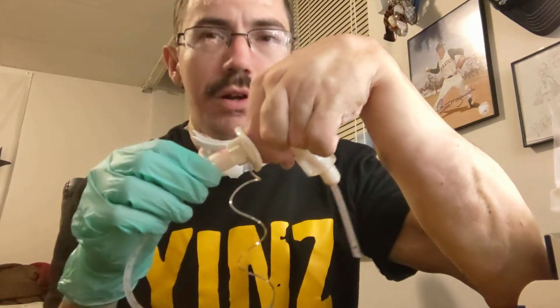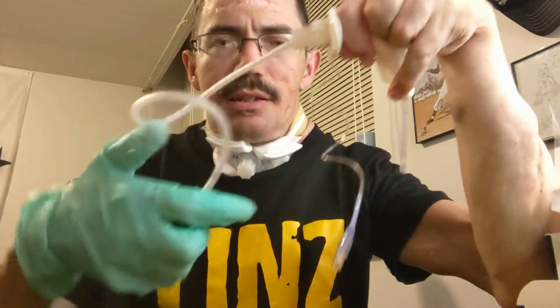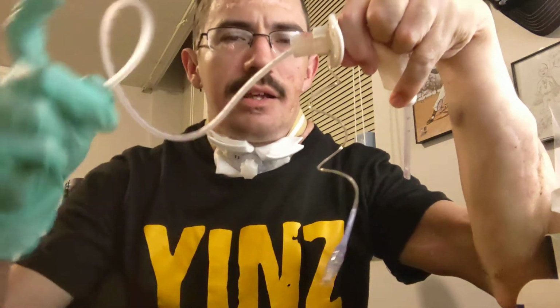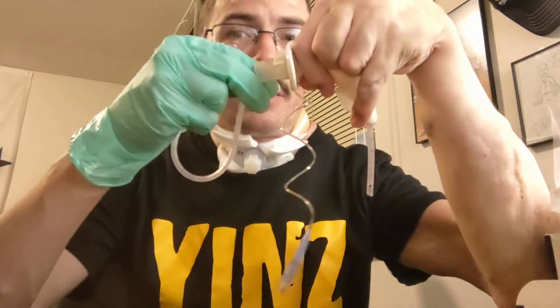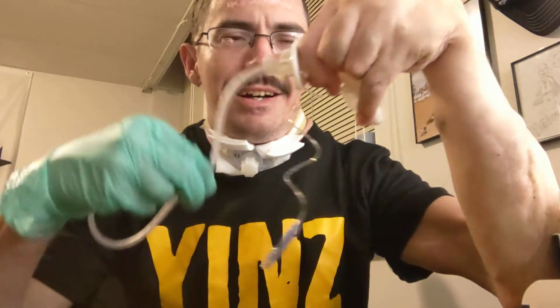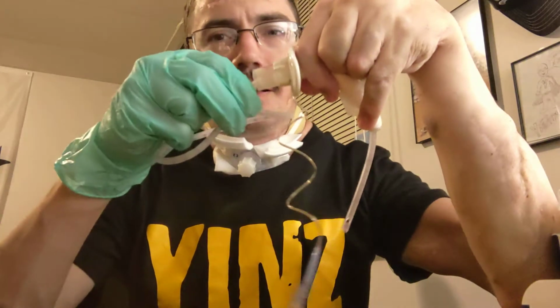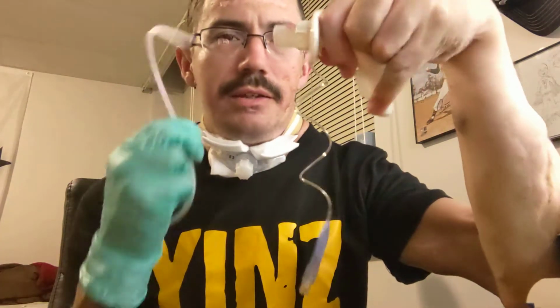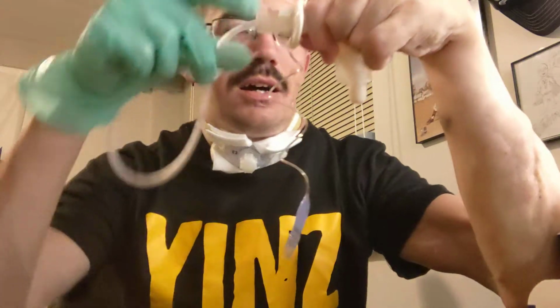and usually your lungs will let you know, hey, this is going a bit far, because you'll feel a bit of coughing. You're going to cough anyway, just because you're suctioning, and it's not a pleasant feeling, to say the least. But then you push down on that, and you pull the catheter out as it sucks it out, and you try to do it slowly, because it doesn't necessarily get it all at one time. Sometimes it'll get some out, and then you have to go back in for more, and sometimes it might happen 2 or 3 times.